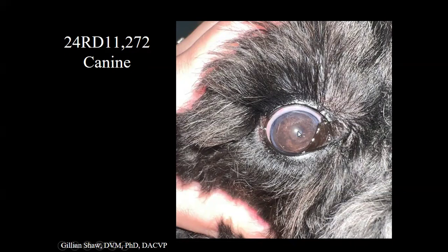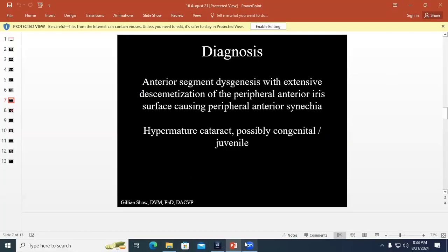So what we can see here is, here's the pupil. It is present and it's quite tiny. And there's definitely something somewhat opaque behind it. So that's probably an indication that we're seeing a cataract through that very small pupil. So we have a miotic pupil. And also, interestingly, there's this sort of grayish discoloration of the peripheral iris. And I personally look at this and think, is that peripheral iris or is that peripheral cornea? I can't really tell. But keep in mind, we did not have this photograph when we received the eye. So let's go look at the histo.